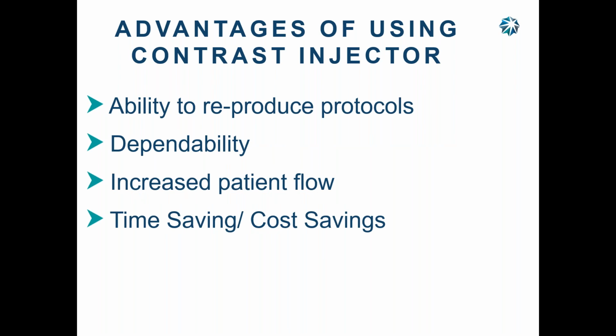So its ability to reproduce protocols, dependability, okay? These are very dependable units. What screws them up the most is, what do you think? Dry contrast. Contrast is conductive. Saline, salt water, is conductive. So what happens when it gets on the board? You get an error, you short something out. If you let it dry, you have a good chance of it working again. But that's the main culprit of injectors, is contrast getting in things, messing up with the sensors and such.